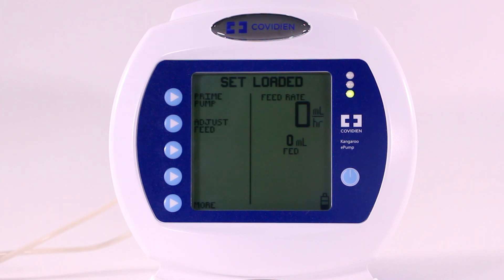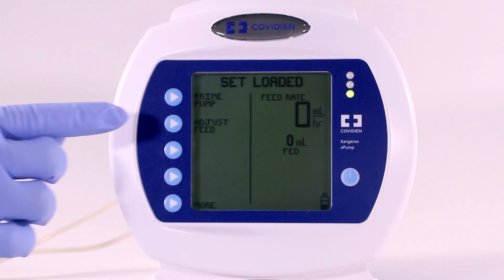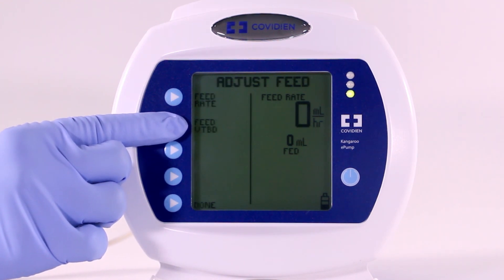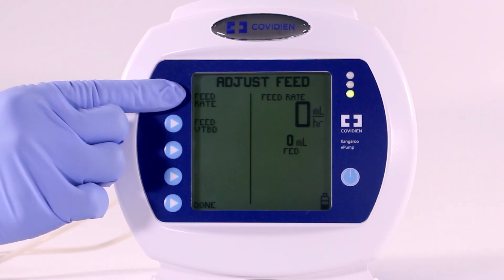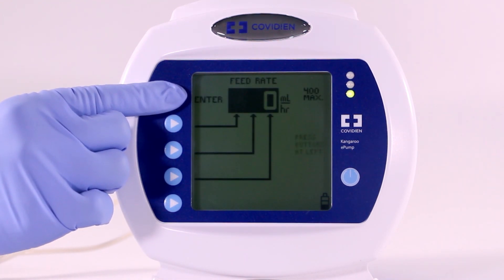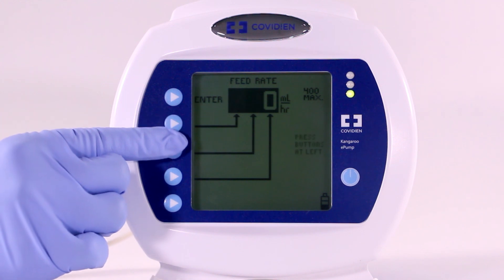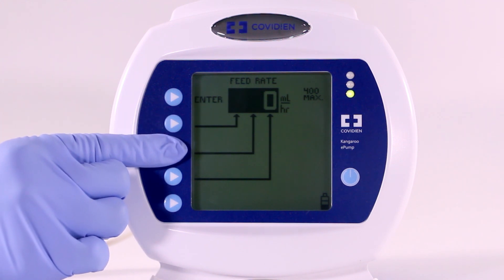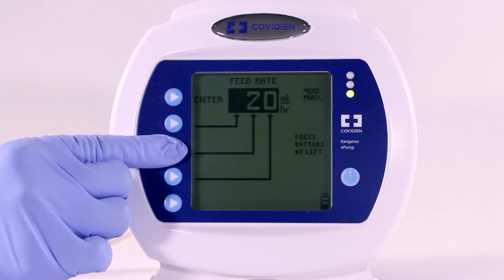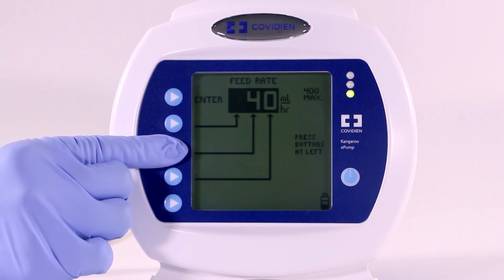To begin, select the Adjust Feed option in the opening menu. Press Feed Rate to define the rate of delivery. Press the arrow buttons to program the feed rate from 1 to 400 in increments of 1 mL per hour.